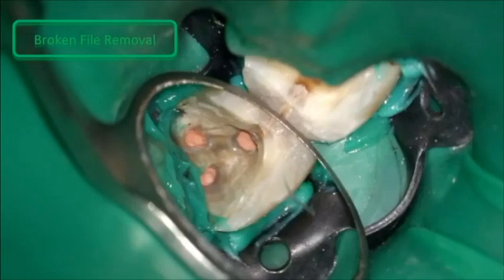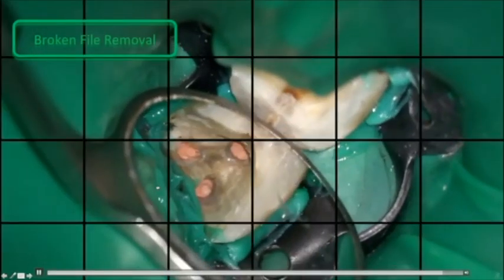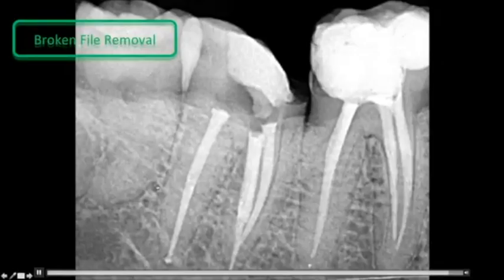Obturation and the final X-ray now. This is the final X-ray. There is more damage than in the first case, but it's still very acceptable.